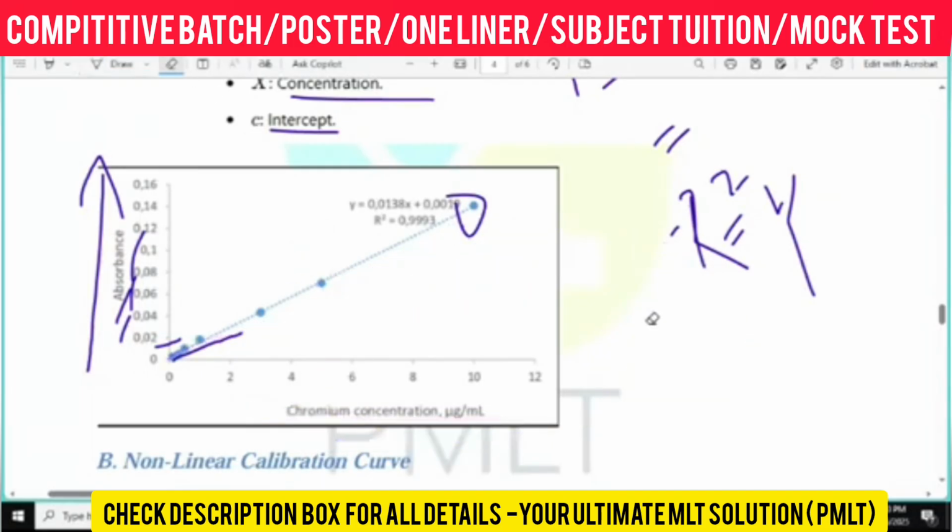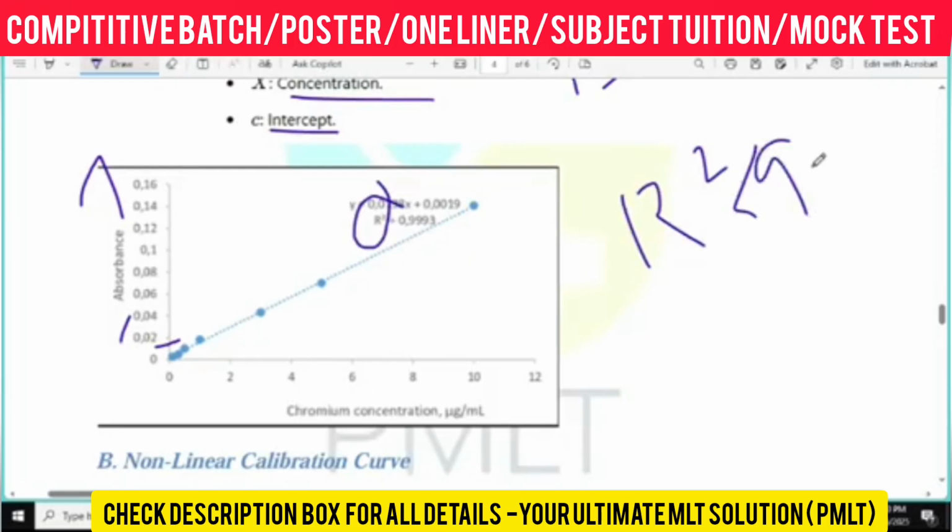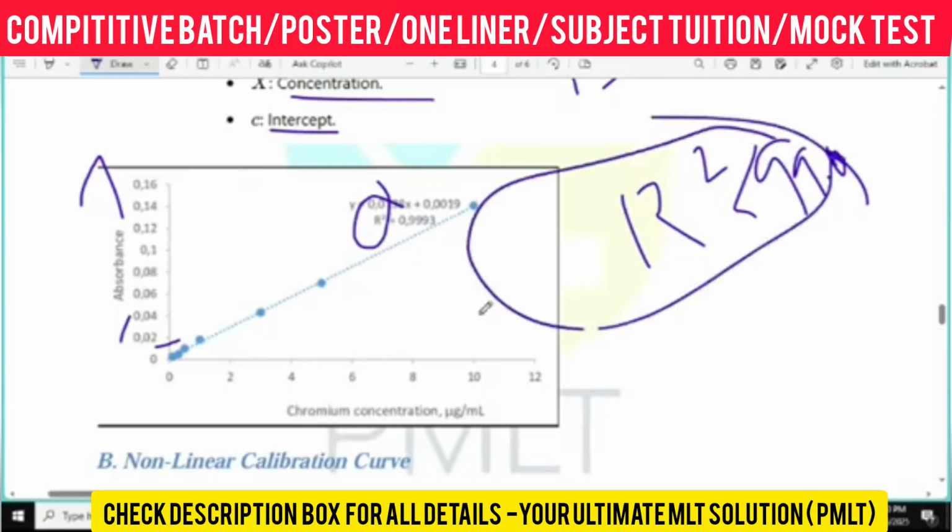I have already told you that if the R square value is less than 0.99, we cannot take this result.